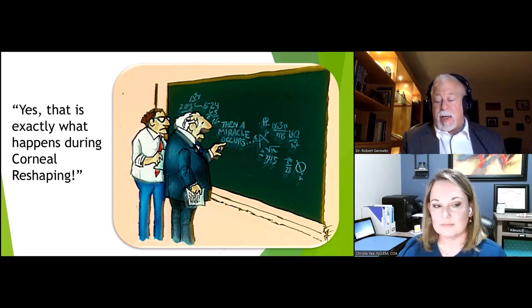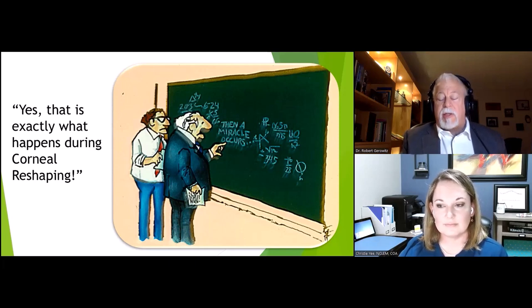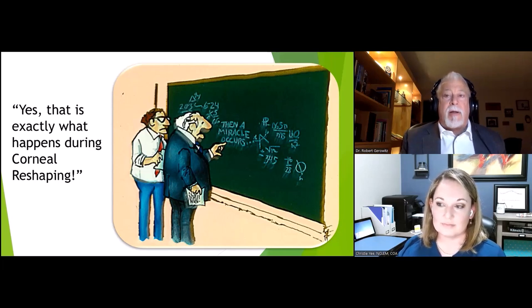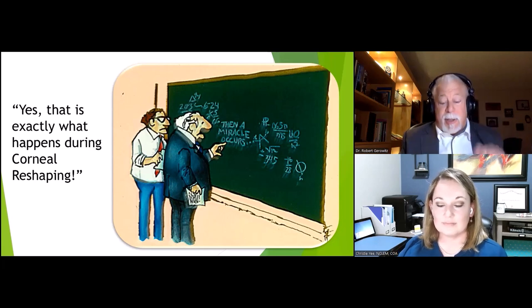From this experience, I learned that as long as the patient is seeing clearly, their corneas are clear, and things are improving or have stabilized at a good level with good results, I don't make any changes. In other words, I let their molds do their thing before I start thinking about making changes. And it's important to remember that a minus 0.25 naked eye post-treatment refraction is within lab tolerance for production, and that a half millimeter treatment zone decentration will not greatly affect VA or their outcome. As a matter of fact, slightly temporal is the new central.